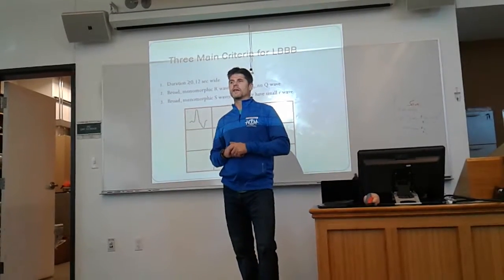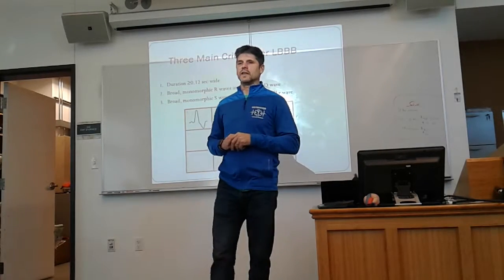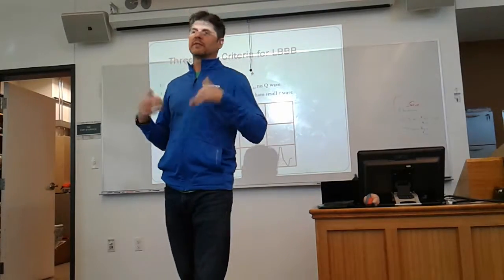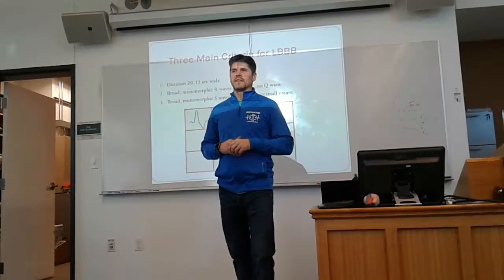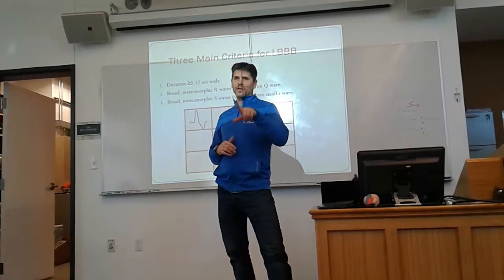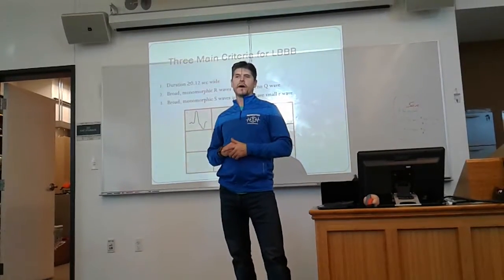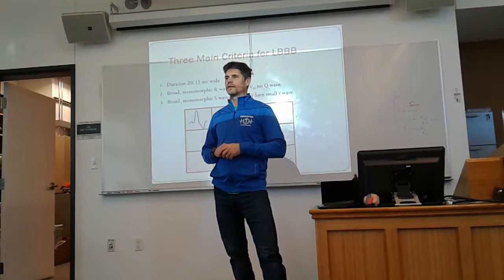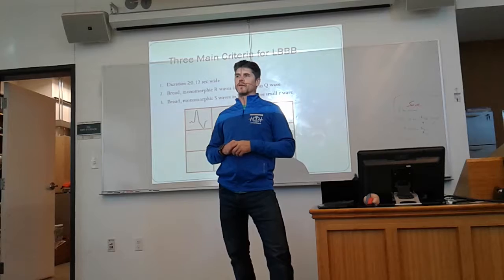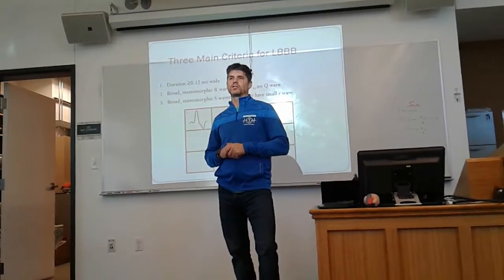And I might make a suggestion to you on EKG from here on out. I think that you should be doing, give or take, 7 to 10 different strips every single day. You should be going through and analyzing 7 to 10 different strips every single day. And it doesn't even matter if you reanalyze some that are already in there. Are you going to post a key? I will post a key. But you should be doing 7 to 10 analyses every day to make sure that you're in the practice of this.